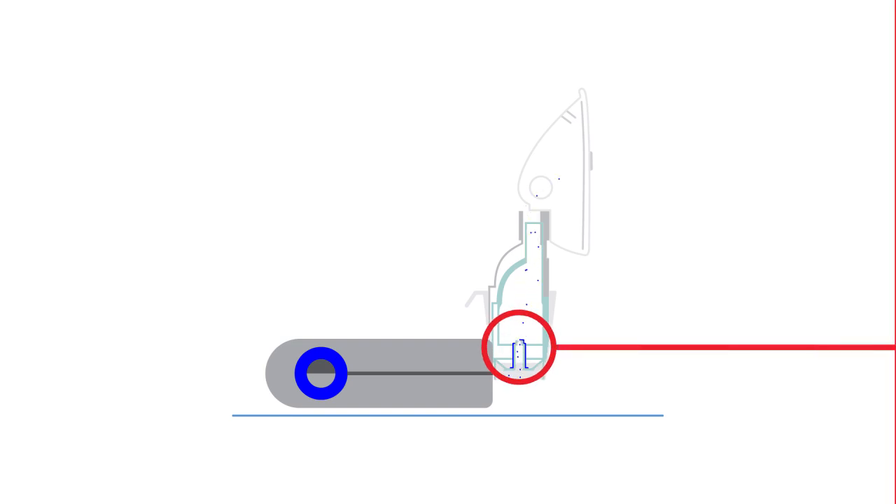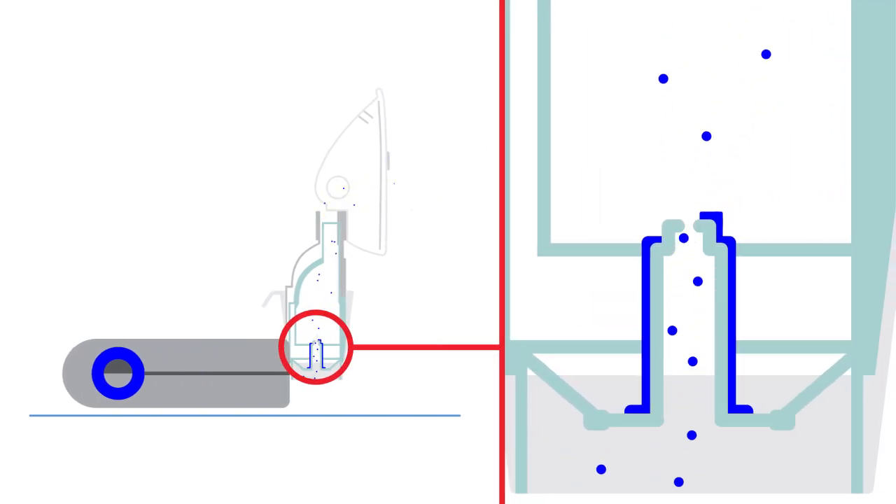Clean the nebulizer kit immediately after use. That's important so the medication doesn't crystallize or get trapped in the nozzle. A blocked nozzle can't deliver medicine at the best particle size and rate. Also, an unclean kit is more likely to attract bacteria and germs.